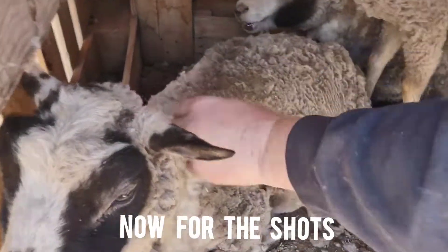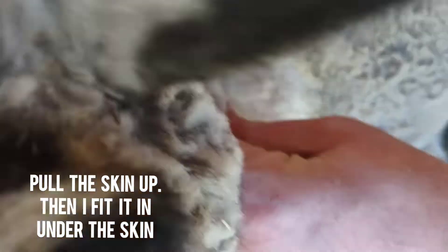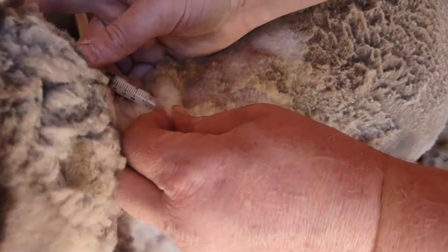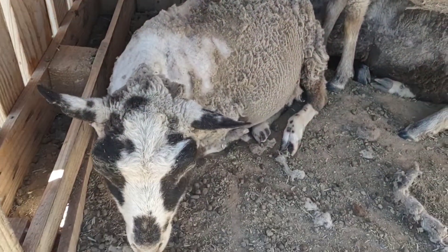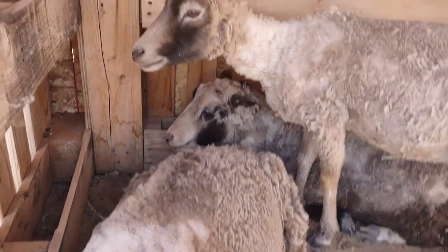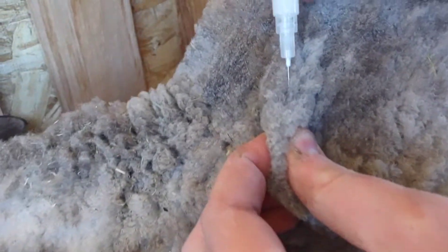Alright, here's how we do the CDT shot. Pull the skin up and then just fit it in right under the skin there. Make sure it doesn't come out the other end — that's a problem you can have. There you go, good job girly. Okay, let's get him — one more because hers is kind of hard to see. Move it girl, you've already been done. Okay Archibald, let's do yours. There we go.